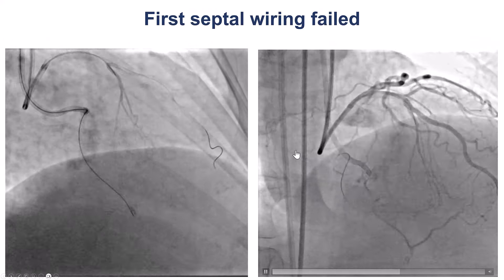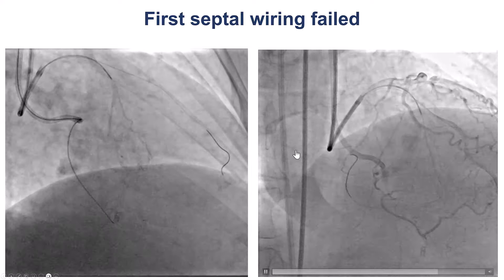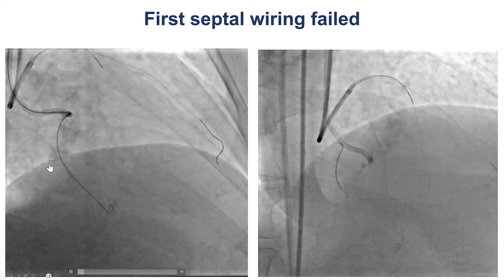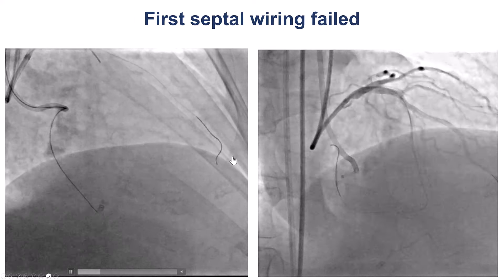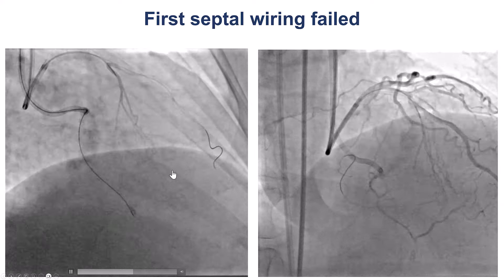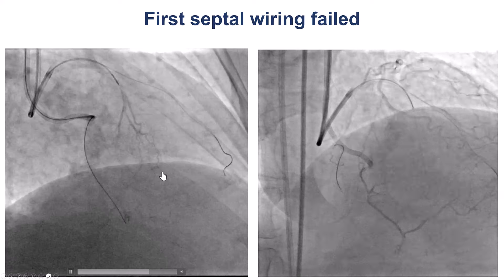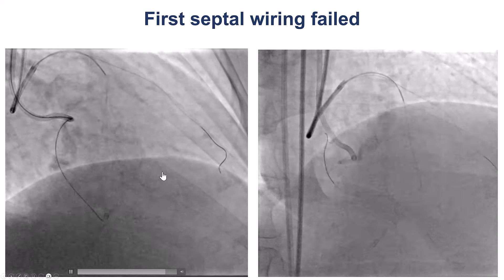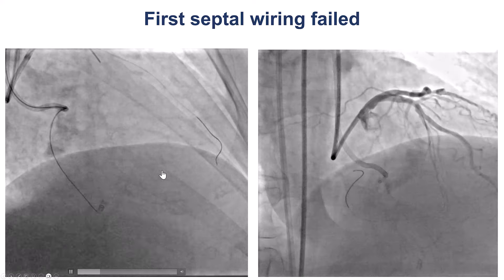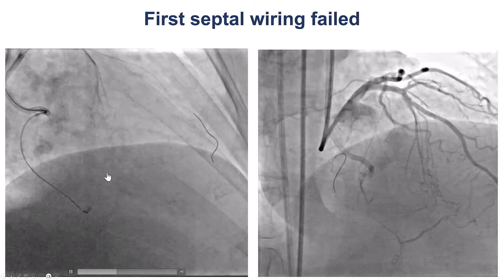So, what are the options here? One option would be to go retrograde. The other option would be to stent into the PDA and the posterolateral. However, given the bifurcation, we believed that going retrograde would provide a better result.